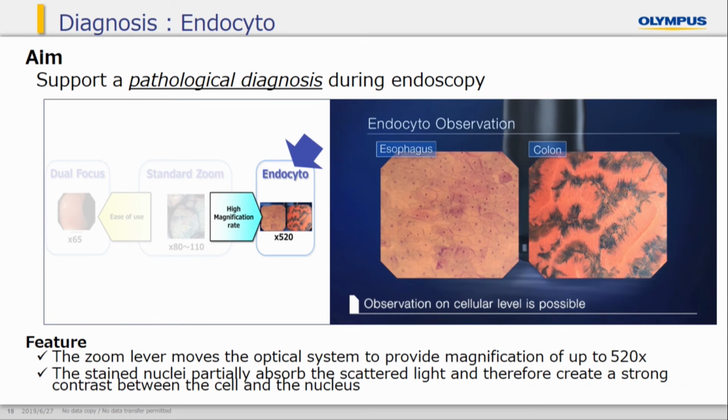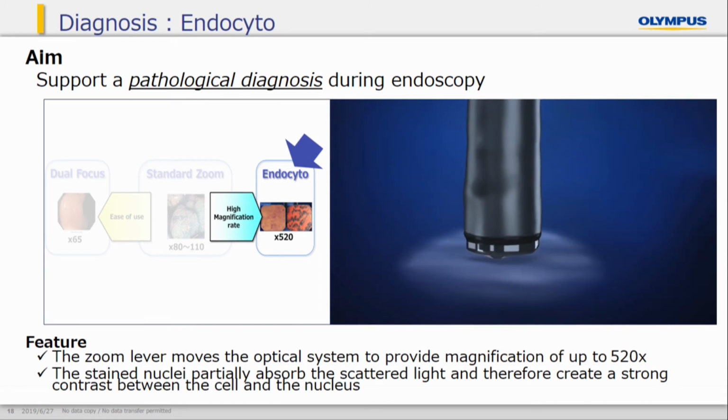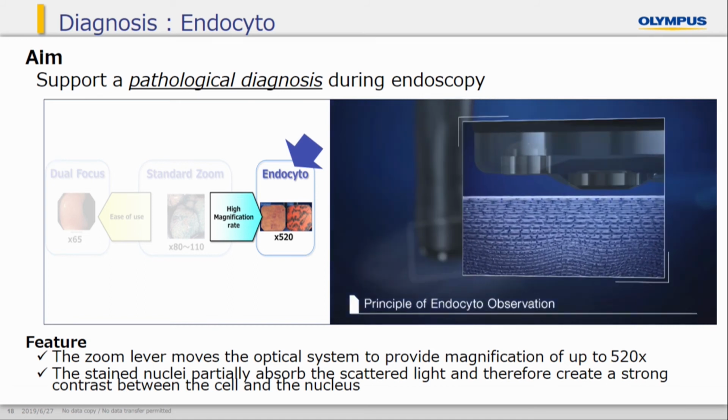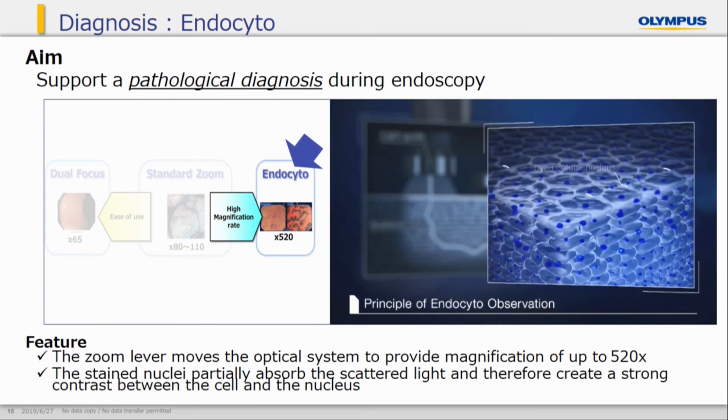These are some examples. Observation at the cellular level is also possible. I won't explain the function in detail, but you can see the attractive endoscope function.